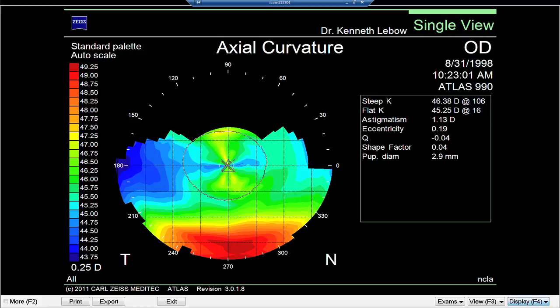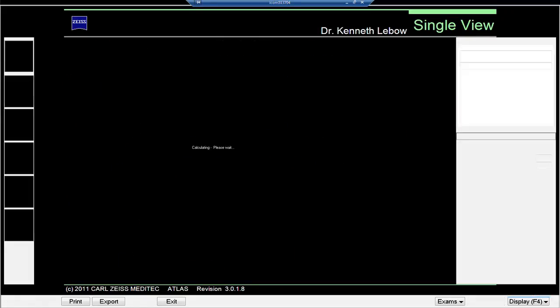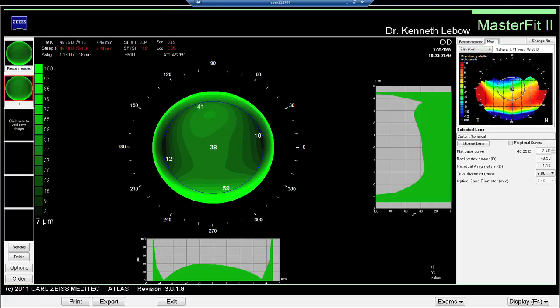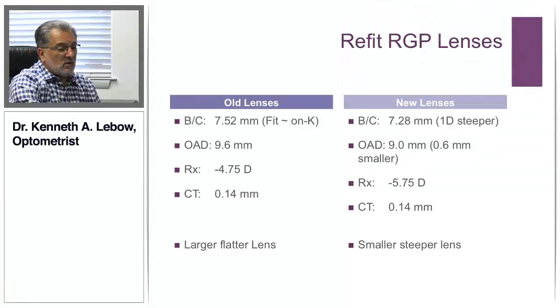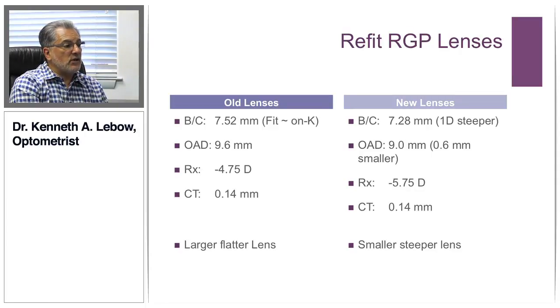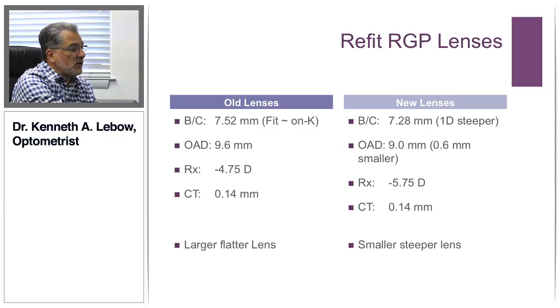Looking at the MasterFit suggestion and the elevation map, what's being recommended is a custom spherical lens with a 7.28 base curve and 9.0 diameter — and actually this looks like a pretty nice fitting contact lens. When I selected the contact lens to fit the patient, I actually used a 7.28 diameter 9.0 lens — significantly steeper than the original 7.52 contact lens. But the lens is smaller, so we really don't see a whole lot of bearing even though we are going quite a bit steeper.